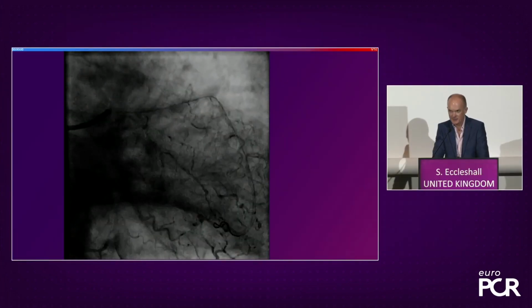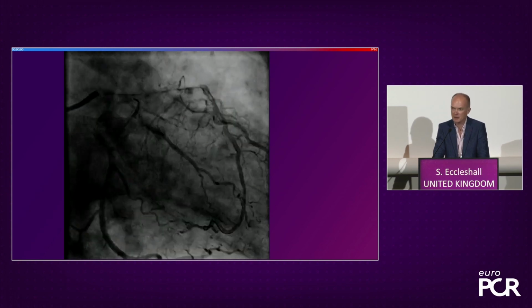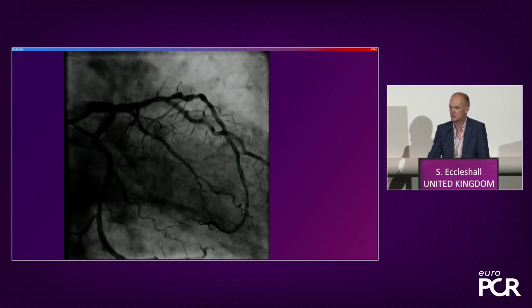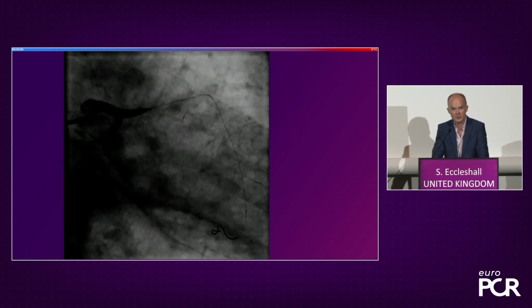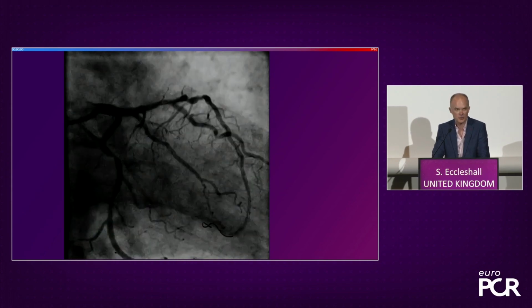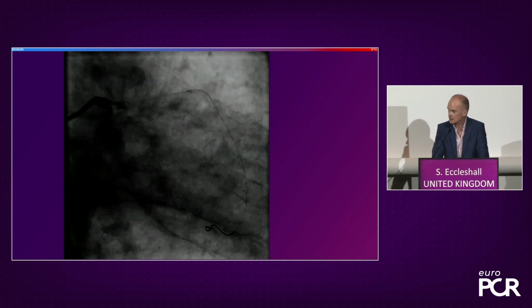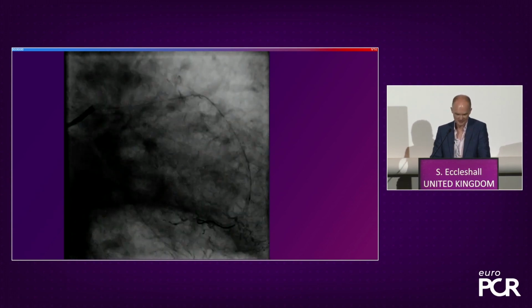So if we hadn't got a good enough result, the first thing we'd do would be go back with the same balloon, a bit higher pressure, a bit longer. If that doesn't work, we change to whichever speciality balloon you like. So we use a lot of Scoreflex and a lot of NSE alpha, again 1-to-1. And again, if it's not working, slightly higher pressure, slightly longer, trying to get rid of, for example, the recoil that you may be seeing. And we discuss this every week, don't we, on a Monday evening.